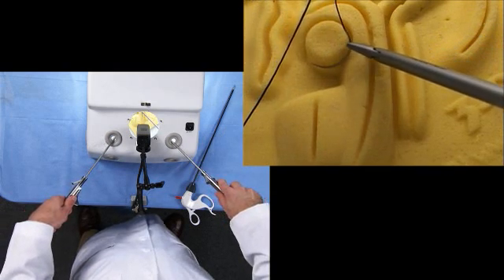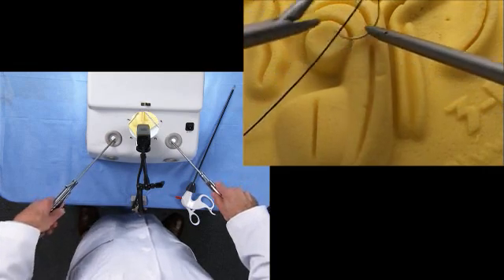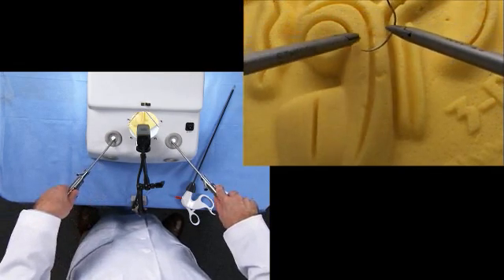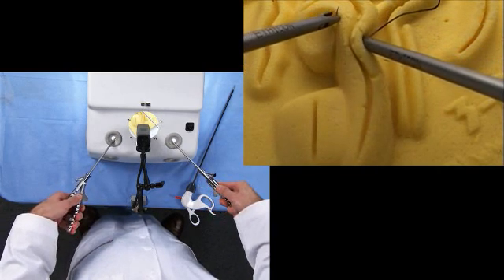Introduce the needle with the left hand, grasp a third of the way from the swedge to the tip with the right hand. We'll penetrate all the way through the tissue with the first bite, though it could be done in two.